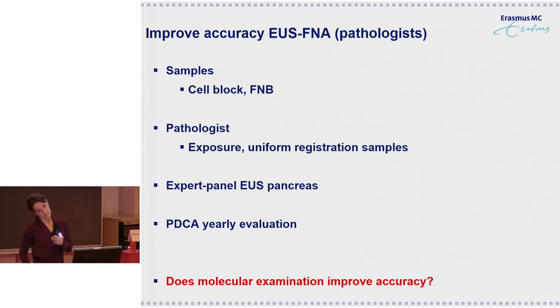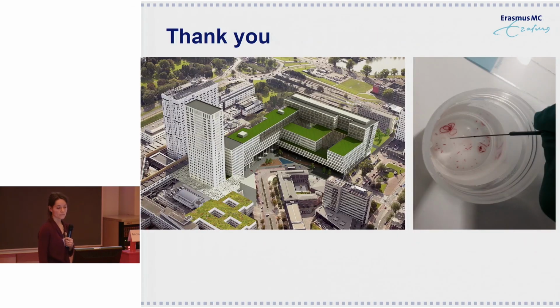Whether or not molecular examination will improve the accuracy, I don't know. We are going to study this, but I hope that some things will change and improve, and in my view, many things will end up in the fluids instead of the glass.